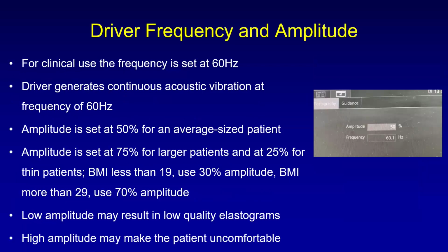And you need to set the frequency and the amplitude of this driver. Because this is actually going to give you the final results, it is dependent on how you send in and what you send in. So the frequency for all clinical purposes is fixed at 60 hertz. And when we acquire these MRE, when it springs up on the console, the frequency is fixed, that is prefixed by the engineer. So if it is set at a value, it remains at that.